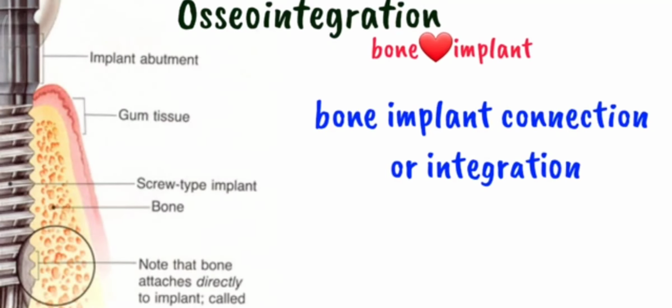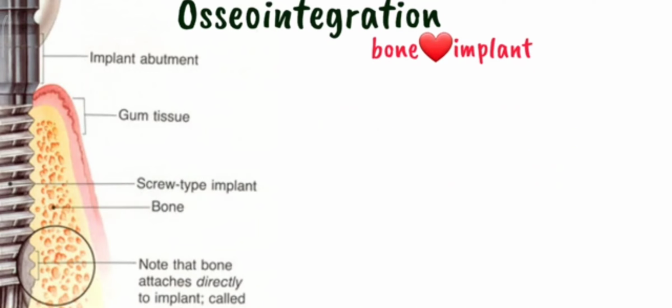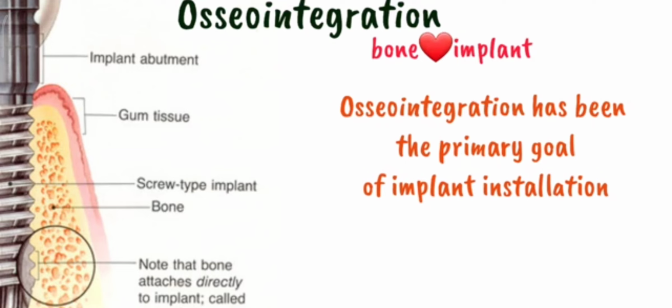Hello everyone. Today let us see about osseointegration. As the name suggests, it is about the bone implant connection or integration. It has been the buzzword in implantology and always the primary goal of implant installation.